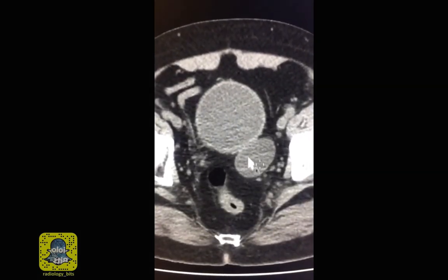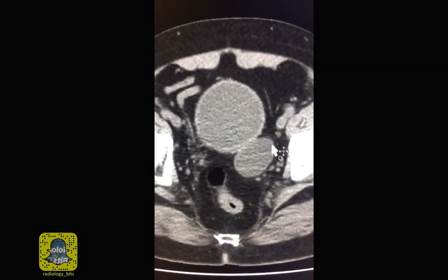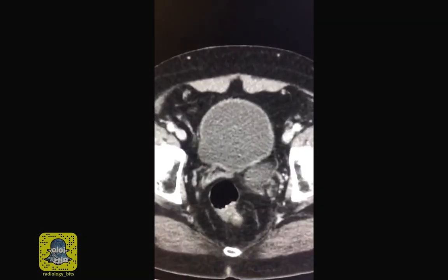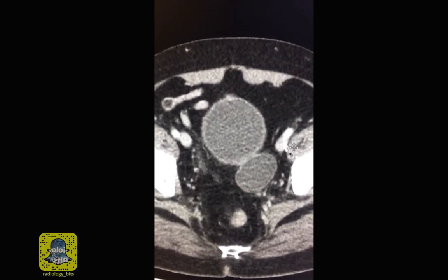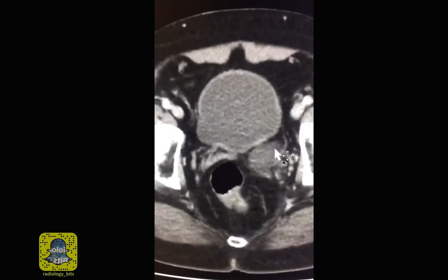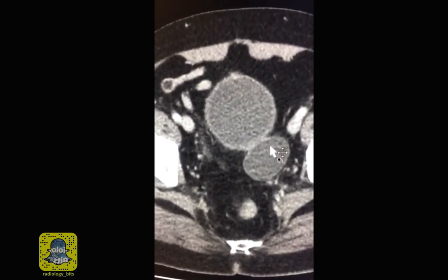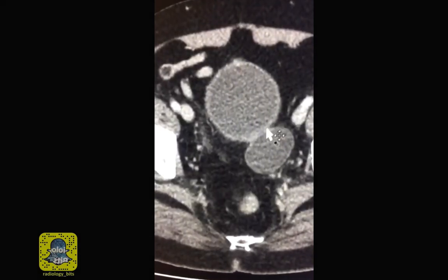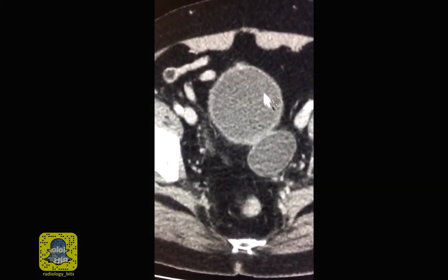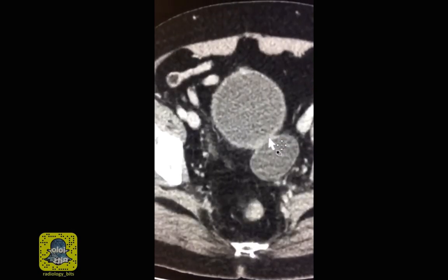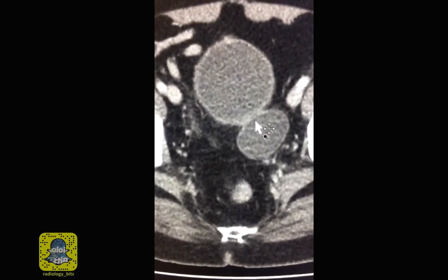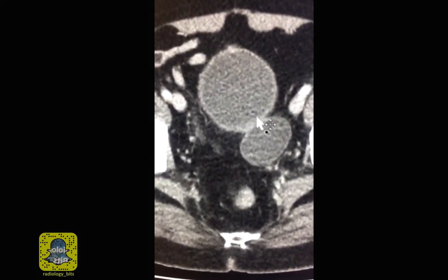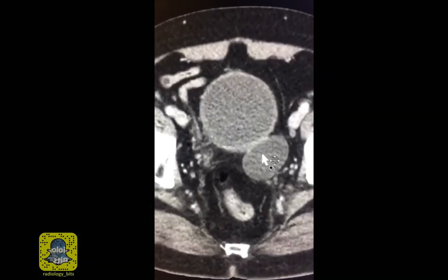To confirm that this has no soft tissue components, we could give contrast and see if we have any enhancing parts. This is the CT on the same patient after giving contrast, imaged at a porto-venous phase where you see both arteries and veins being opacified. Yet the structure here doesn't have any obvious enhancing components — maybe a very thin rim of wall enhancement. Since the structure is closely related to the urinary bladder, let's make sure it does not connect to it.